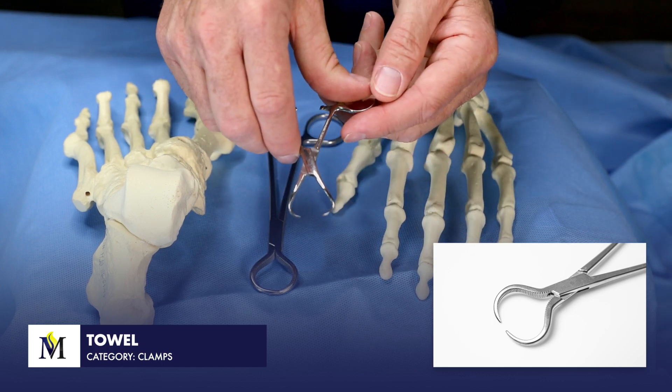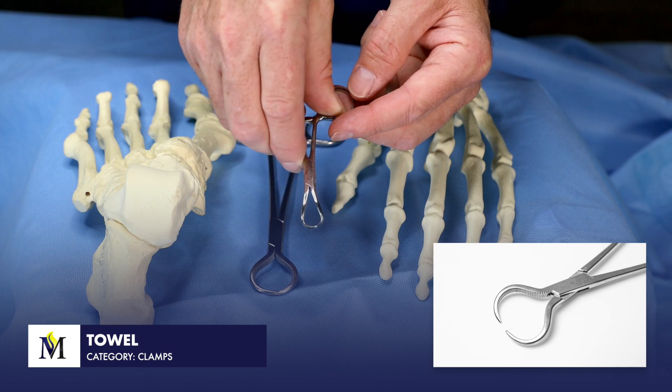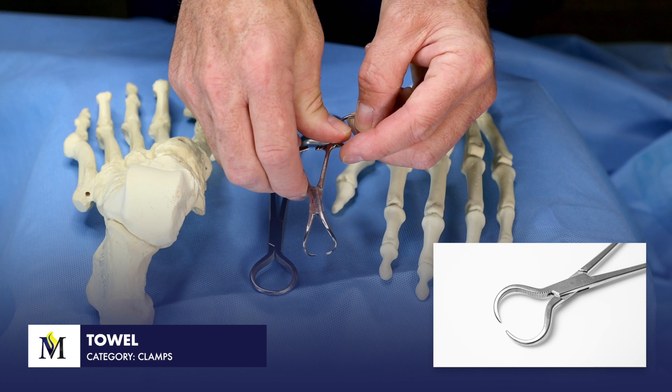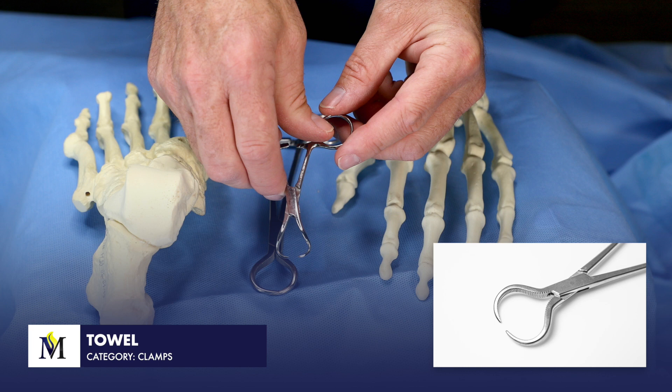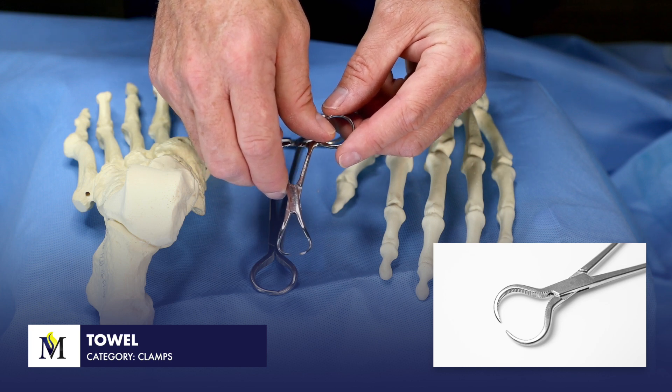However, still with a very sharp distal tip, these are working clamps. The towel clamp is used for grasping and securing drapes, and can also be very aggressive in grasping and holding together pieces of soft tissue.